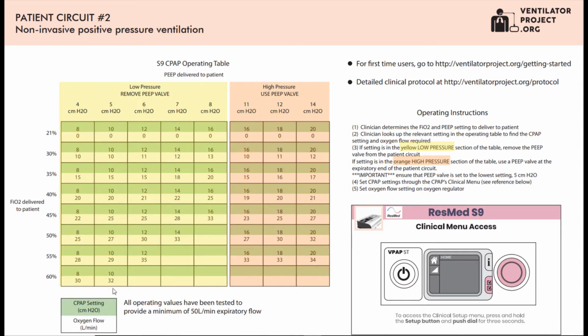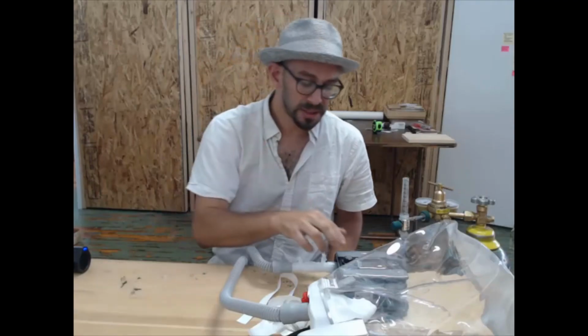And here at the top, that's my CPAP setting. So in this case, this is 10 centimeters water pressure. And at the bottom, that's my oxygen flow, which is 27 liters a minute to get 50% FiO2 in the circuit. So let's go ahead.